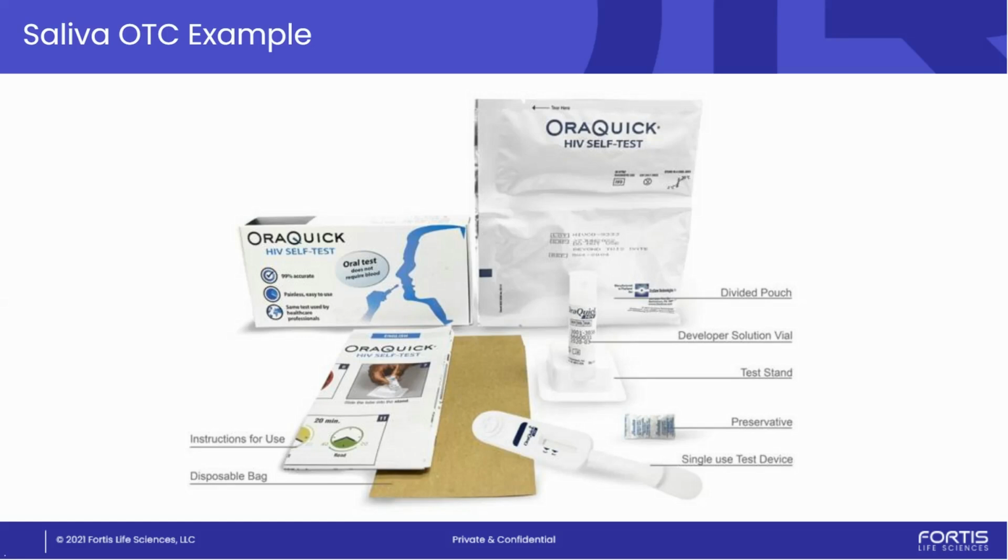It really changes how you look at sample collection and normalization and such. But I'm going to make an assumption that if we're talking saliva, we're talking in the OTC space. And the OraSure is a great place to start when you're looking at what it is that I'm trying to make. So quickly going at this, and those 3 considerations I just mentioned.